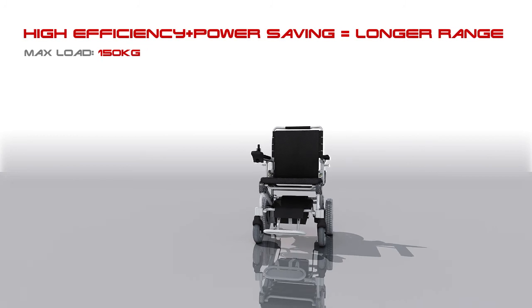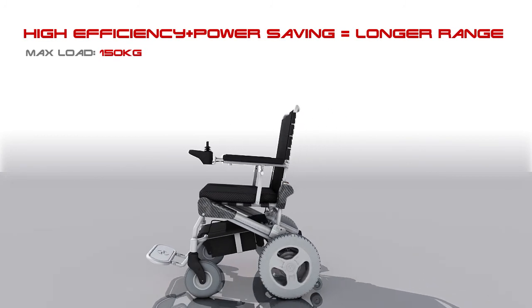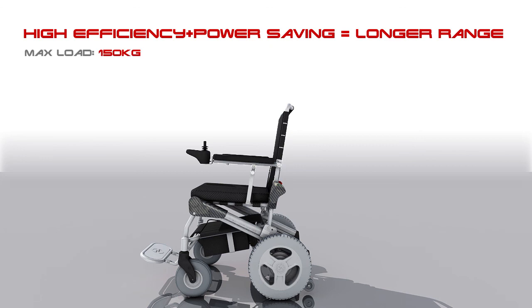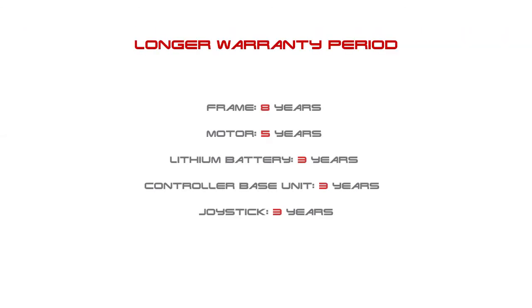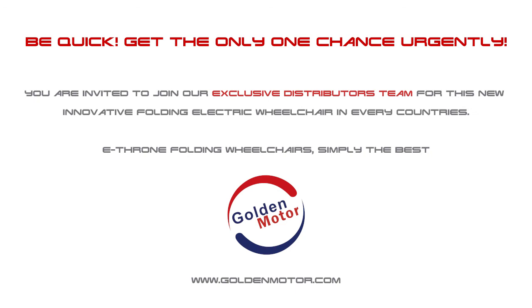24-volt, 180-watt or 250-watt brushless hub motor — high efficiency plus power saving equals longer range. Max load: 150 kg. Longer warranty period. eThrone: the best personal mobility aid. Welcome to join the Golden Motor exclusive distributors team for this new innovative folding electric wheelchair. Be quick and get a good chance — we'll see you on the news.